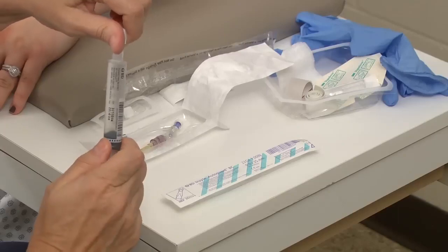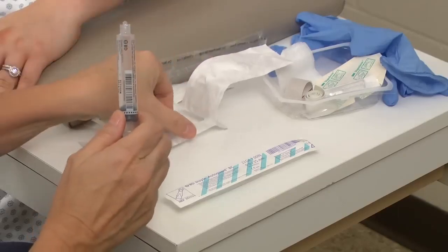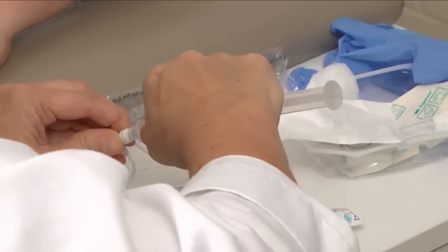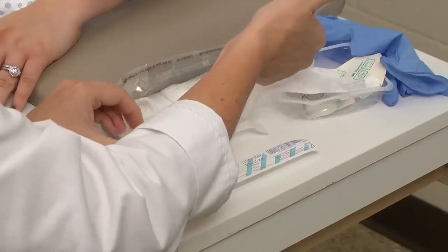Next, flush the saline lock and extension tubing. This will ensure the tube is patent and prevent air bolus to the patient. You will need to flush all ports on your tubing.